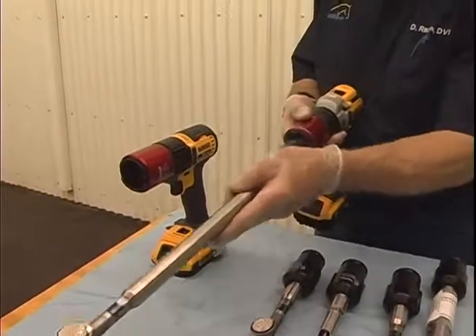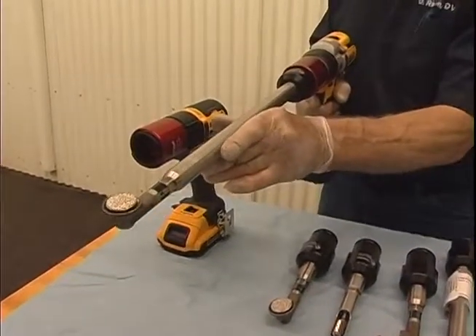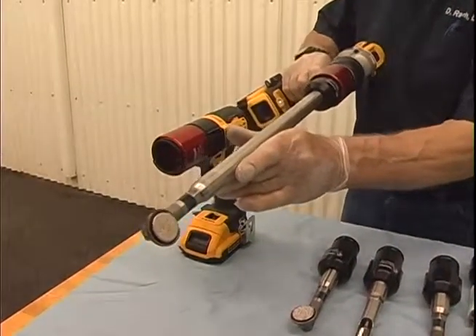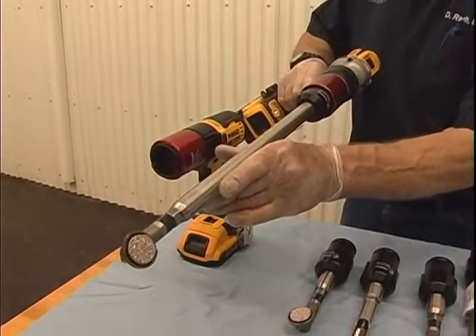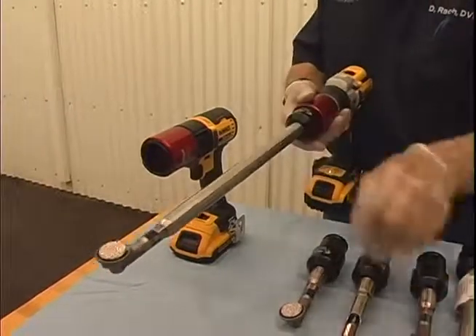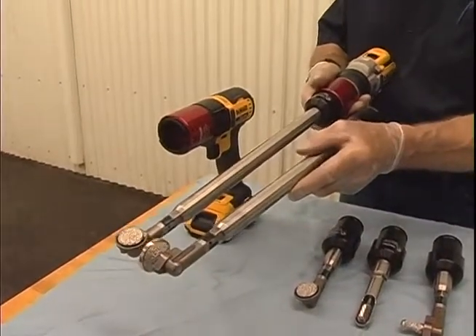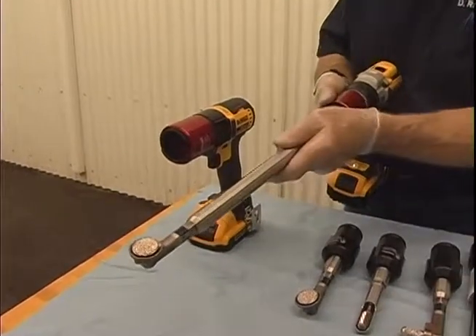If you're using nothing but the right angle to take off sharp enamel points, you would have to tilt it to float off the sharp enamel points, which means your elbow is turned out, and that is a little harder on people that have bad shoulders or elbow injuries. So the chamfer burr makes floating much easier just because of the way you're holding the gun in a natural position.